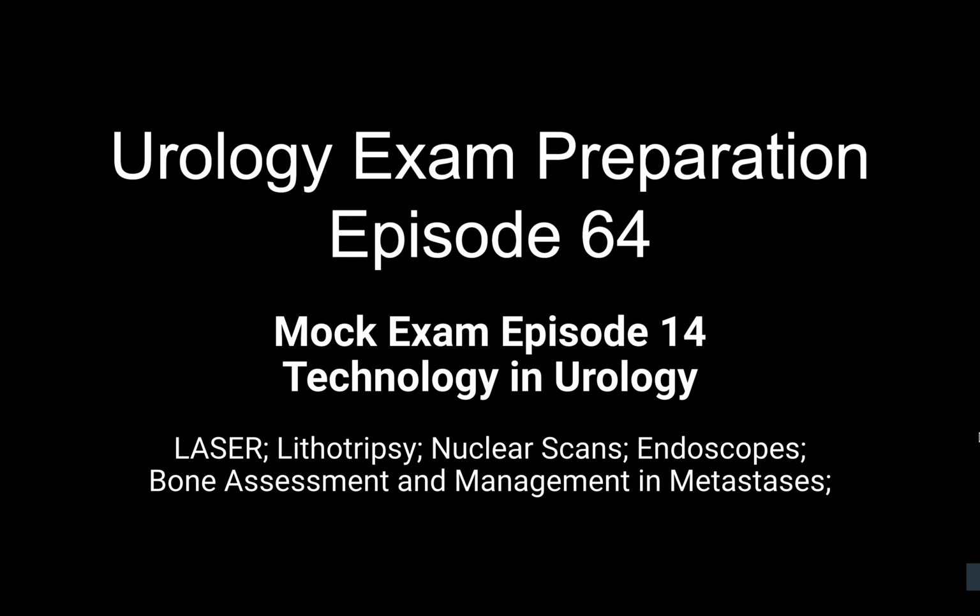The reason we are using the term indirect micturating cystourethrogram is that in the MAG3 studies, we are not instilling the MAG3 radioisotope via a urethral catheter into the bladder. The patient's kidney filters the MAG3 isotope and it accumulates in the bladder.